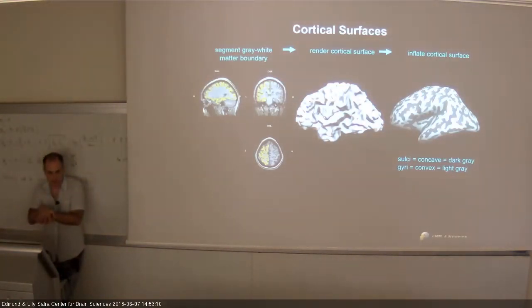And why choose one of them, there's a reason I don't want to go into now. But basically, in the end, what happens is that some software, for all this processing, we use some software. This could be SPM or FSL or Brain Voyager. I don't know if you heard about it. But every software uses one of these approaches, this template.